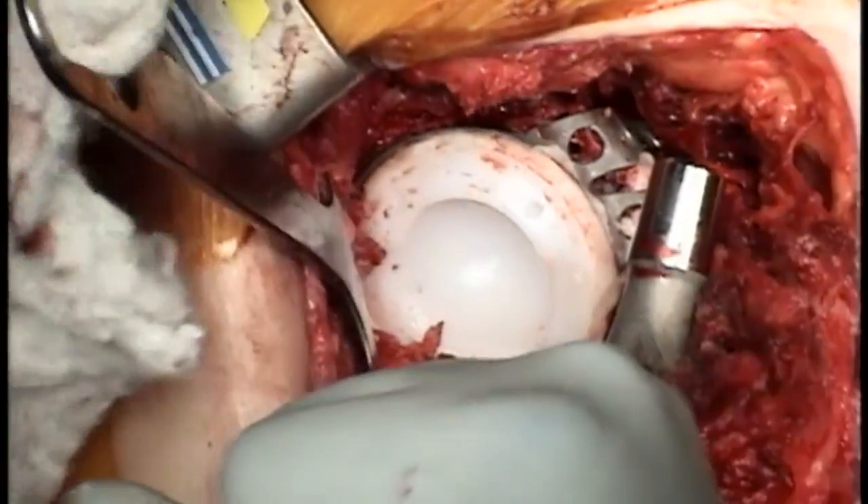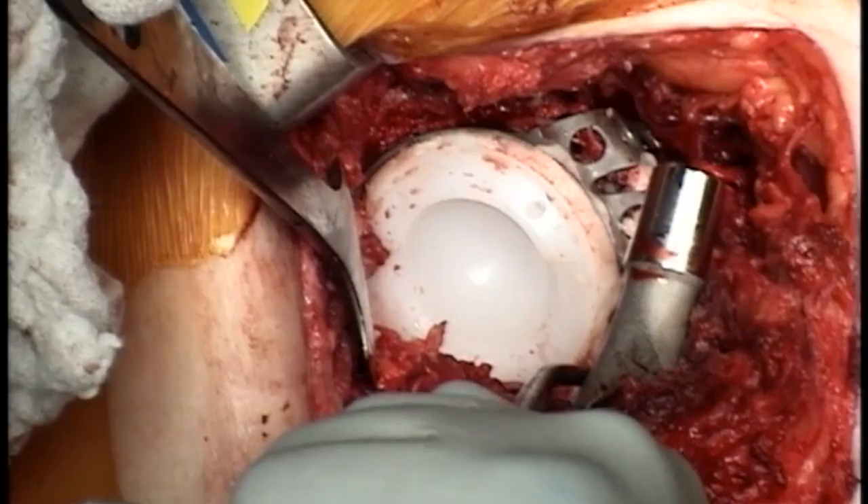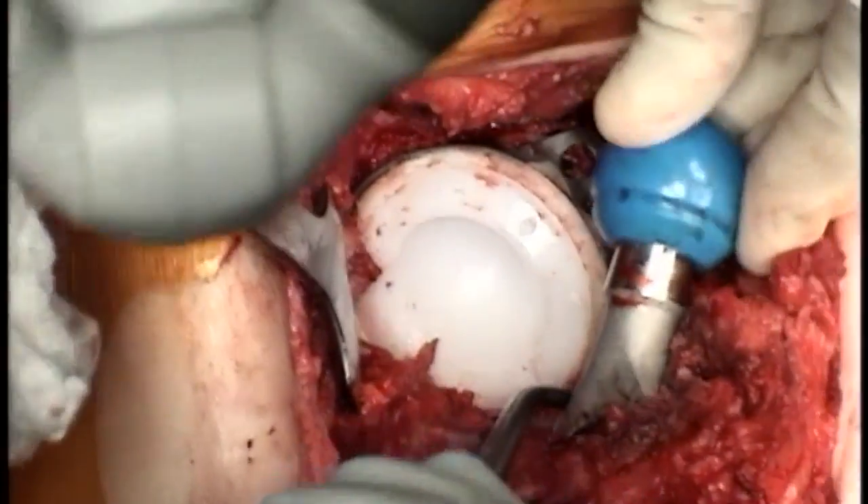We can now remove the femoral stem from the anterior pelvis where it has been for the entire procedure, and start to place our trial heads and reduce the hip. The patient comes out to full extension, full extension external rotation, stable at 45 degrees in full extension. We flex to 90 degrees and rotate to 50 degrees.